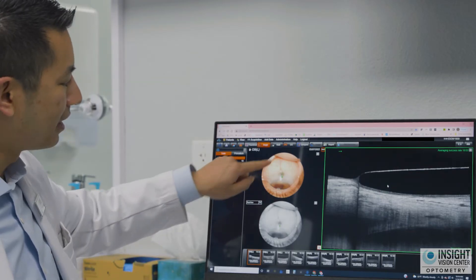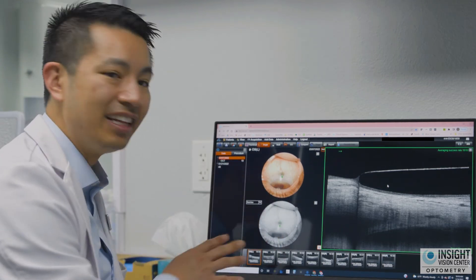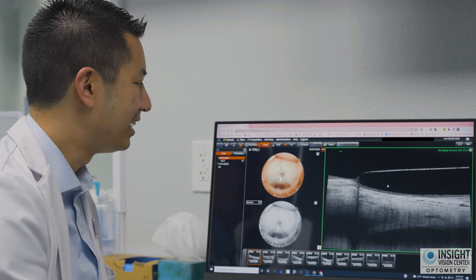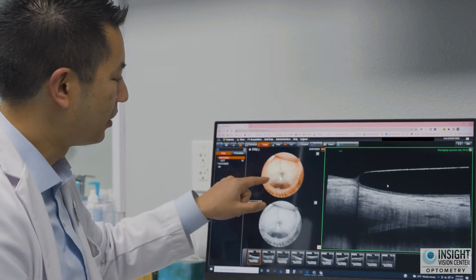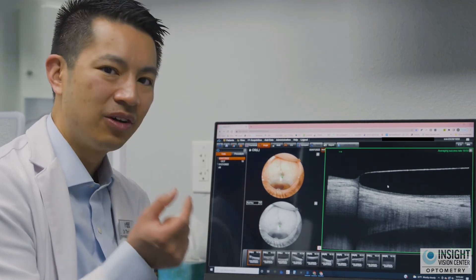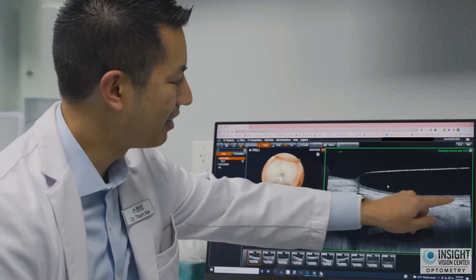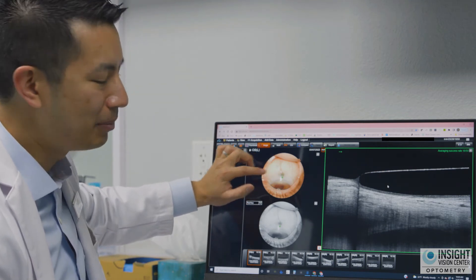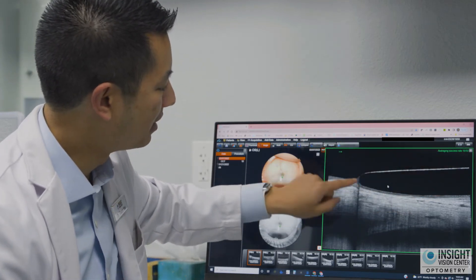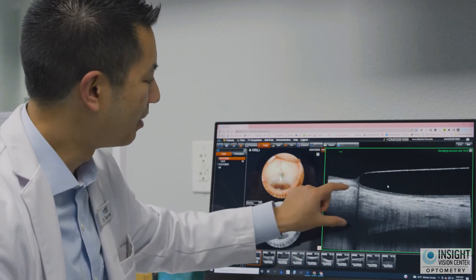Here's an example: on the left you can see a picture of the patient's eye with the scleral lens on it. We document it with videos and photography to see how the lens is sitting on the eye. Not only should they take an image straight ahead, they should also scan the lens on the eye using a device called the OCT. The OCT shows how the lens lands — this big black thing on top is the scleral contact lens edge landing on the eye.